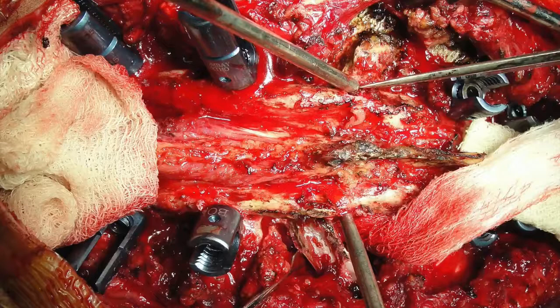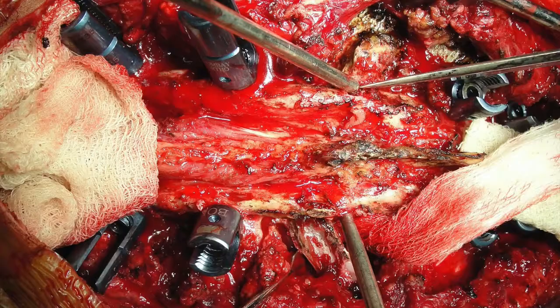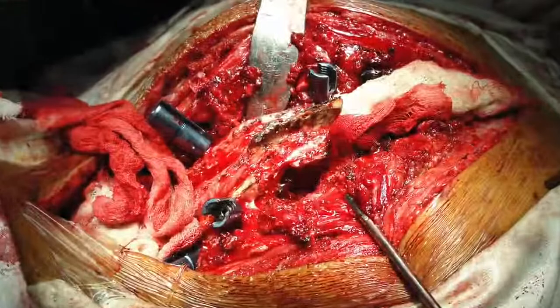Bilateral extracavitatory approach was performed after removing proximal portions of the T5 rib. The T5 vertebra was decancellated first, leaving behind the posterior elements intact.